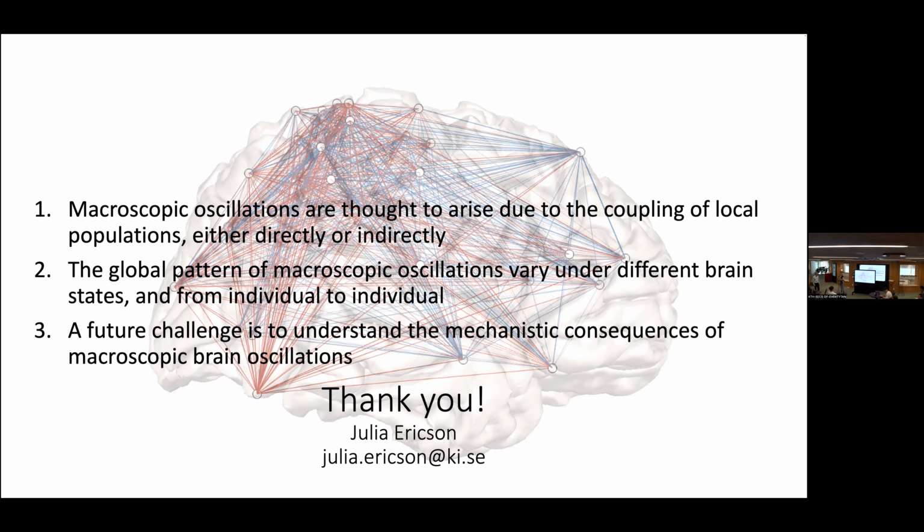Yeah, so I didn't show that now. You mean that during this one second, there might not be coupling during the whole second? Exactly. It makes no sense to calculate the phase locking value when the oscillation is not there. Yeah.